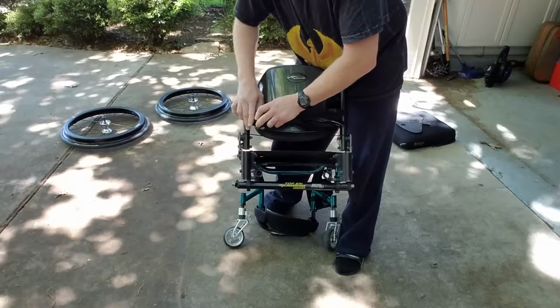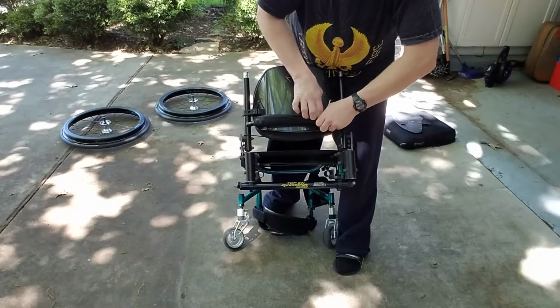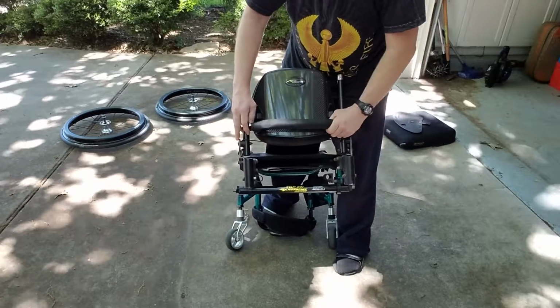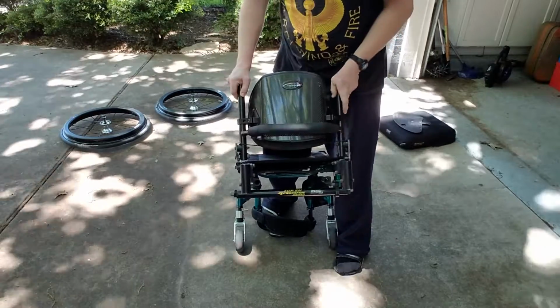We just disassembled it to show you what the different components are, just so you see how it works. But then once you get it cinched in good, twist it around, and now you've got a soft thing here on the back support.